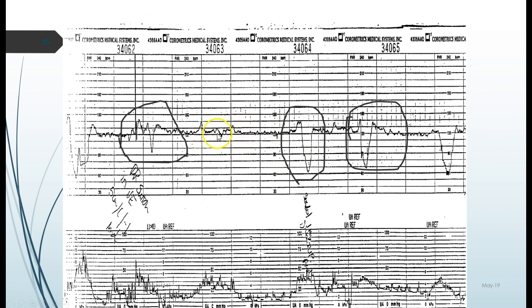Again, look, we've got good variability through here. This is moderate variability. We've got good fuzzies on our baseline, starting to decrease a little bit over here, but over here it looks good. We start to flatten out too much, and these start getting much bigger or much deeper. We're probably going to expedite delivery, as in she's 5 centimeters. She's only halfway through. She may end up with a cesarean delivery because our baby is not tolerating this.